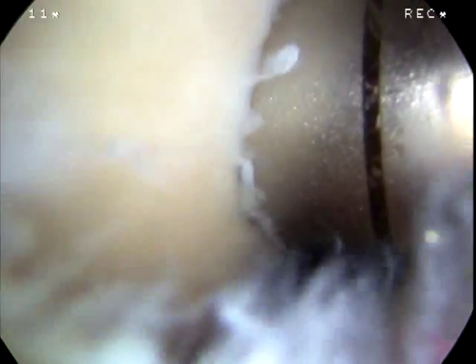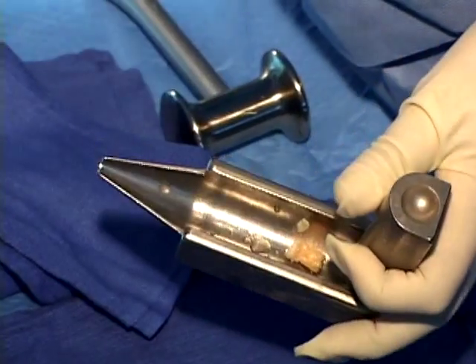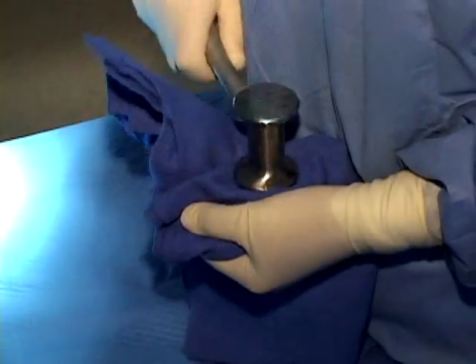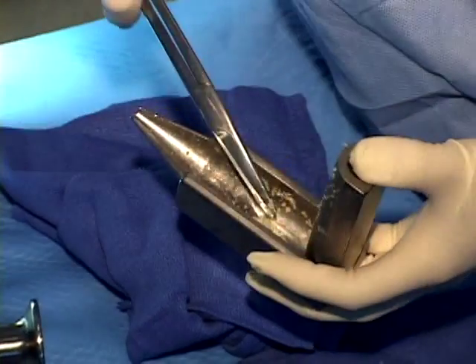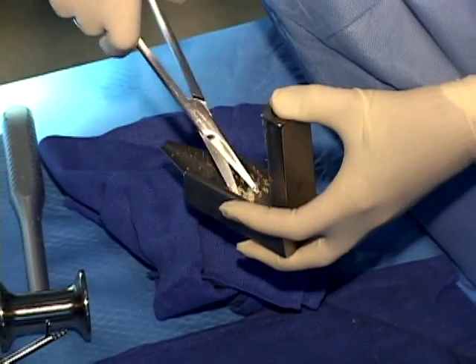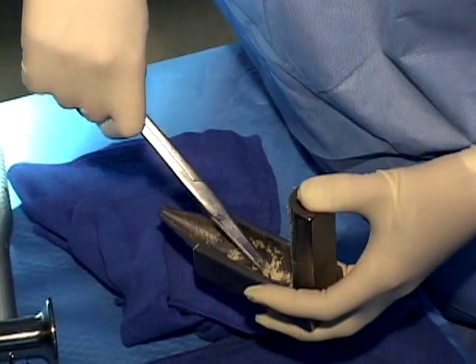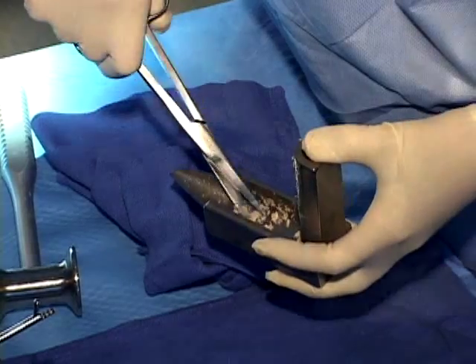Multiple cores can be obtained from the intercondylar notch if necessary. This clearly depends on the size of the lesion to be grafted. The cores are placed into a bone graft smasher which is then impacted on the back table with a mallet. The graft is smashed until it forms into a paste. Excess soft tissue is removed with scissors and the paste is cut up into small pieces and impacted again.